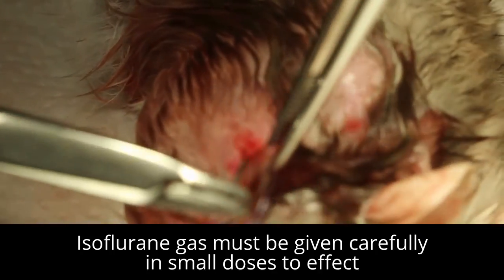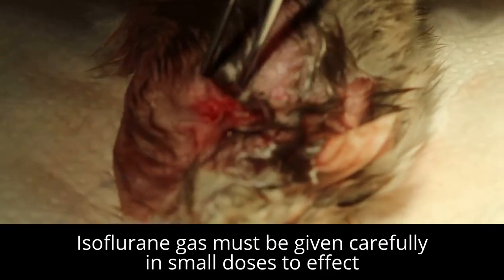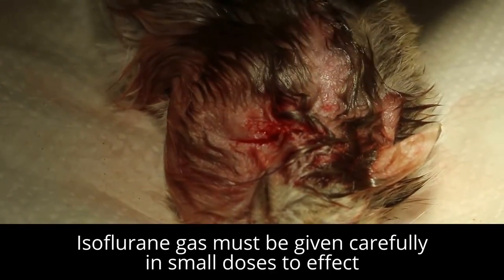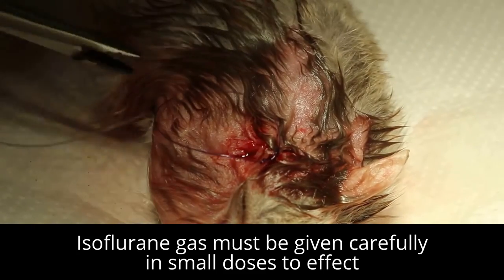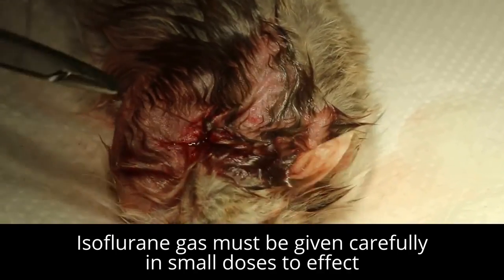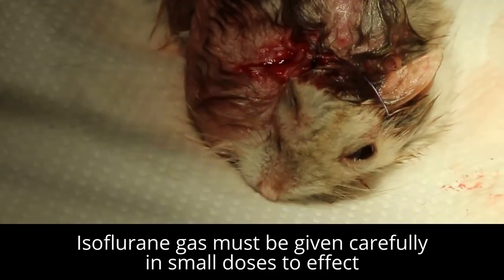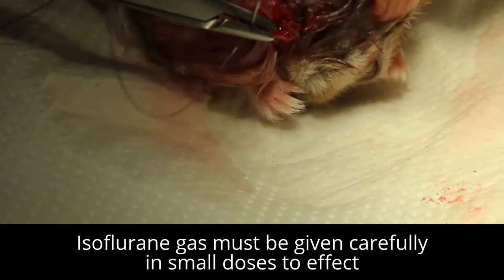Now it's a bit of bleeding, but this will stop after suturing. If the tumor is smaller, then no need to stitch, but it's quite big. Okay. Can see 1, 2, 3. Stitch 1. Stitch quickly. Go ahead, put in again.